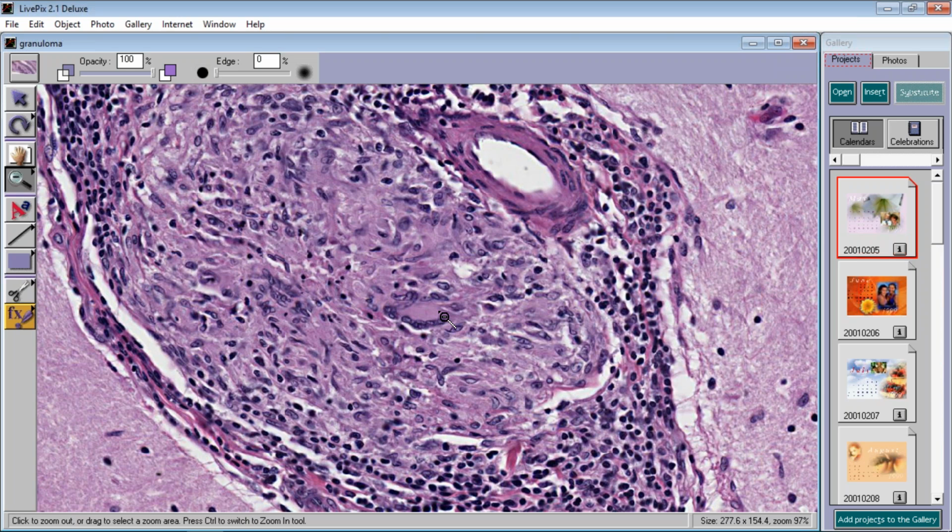So in all honesty, all you could say is that this is a granulomatous meningitis or a granulomatous cerebellum, whatever you want to call it. But let me ask you another question. Does the inside of this granuloma still have viable looking cells with nuclei, or does it look like it's necrotic? In other words, are the cells just as visible on the inside of the granuloma as they are on the periphery of it? Yeah. So this is a non-caseating granuloma.